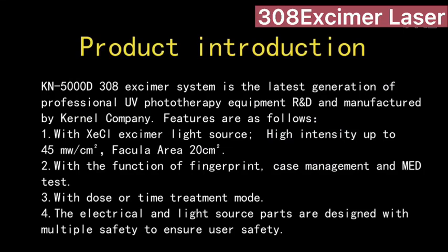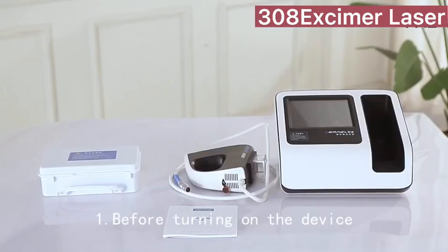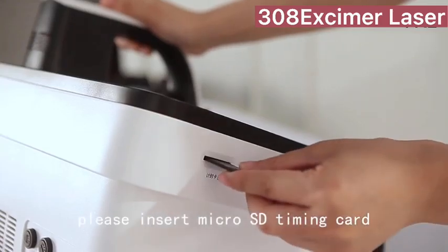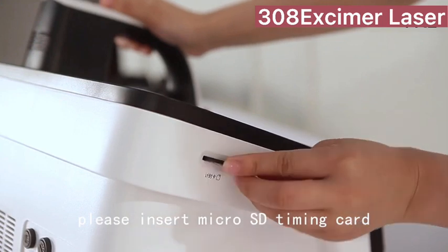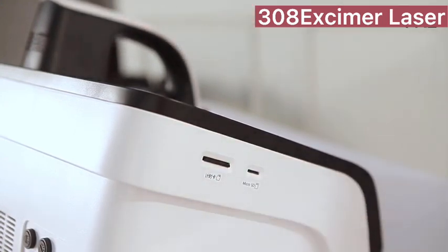KN5000D308 Nanometer Excimer System. Check before using. Before turning on the device, please insert the microSD timing card and data card into the corresponding card slot.